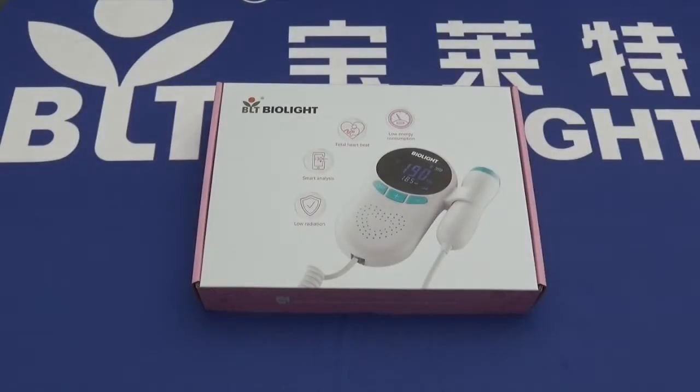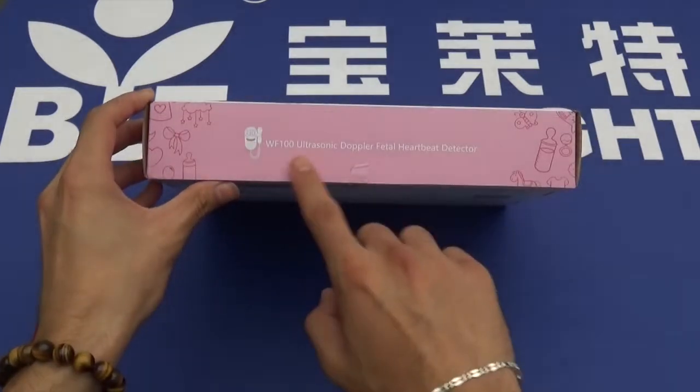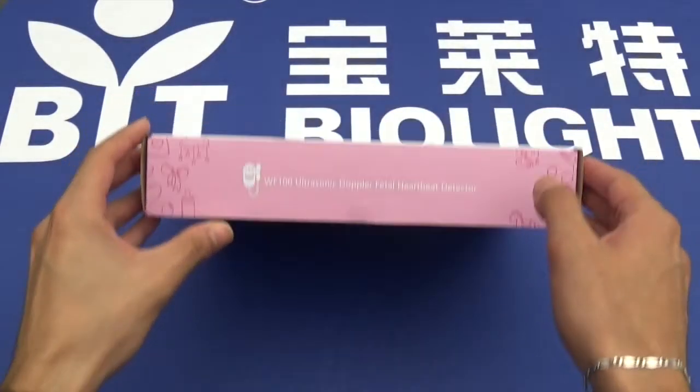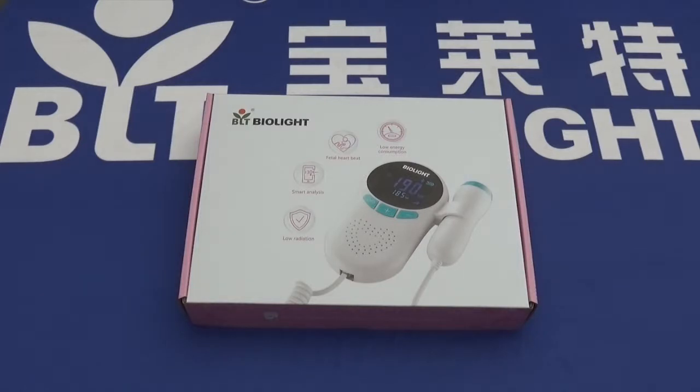Hello and welcome to an introduction and unboxing of BioLite's WF-100 ultrasonic Doppler and fetal heartbeat detector. This product boasts a compact, ergonomic, and portable design, a built-in speaker, and a large display for better viewing and accurate fetal heart rate detection with high fidelity.